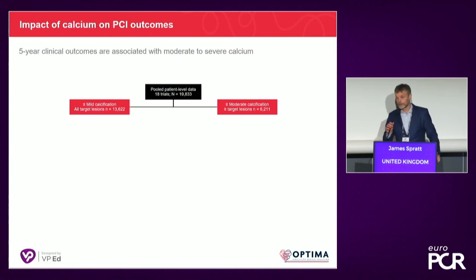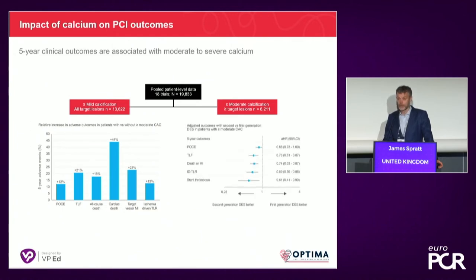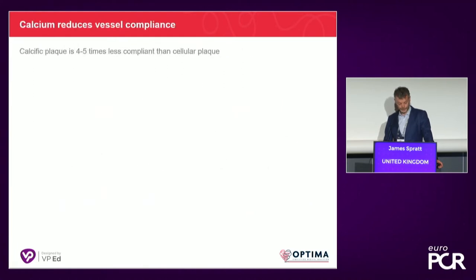I think the reason we're in this room and why this topic remains of interest is that calcium remains the significant limiting factor in all coronary interventions. We like to segment CTO PCI up into its own little box, but the outcomes in terms of lesion durability are the same in terms of mean stent area and durability than they are for standard PCI.